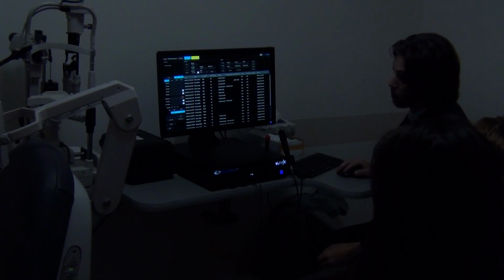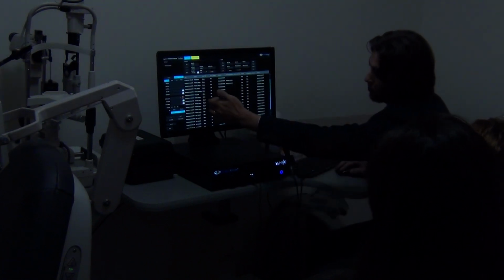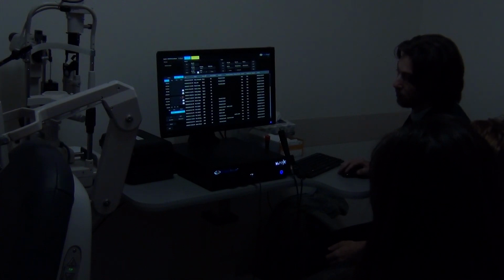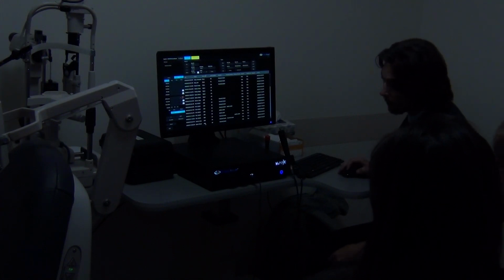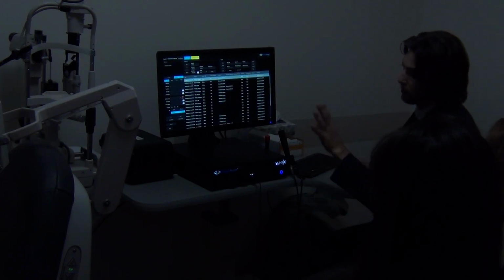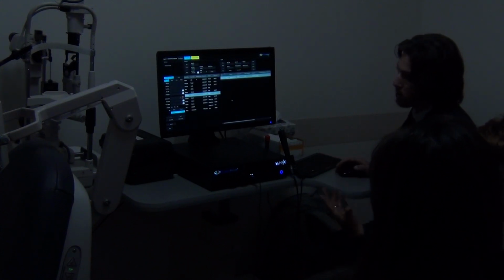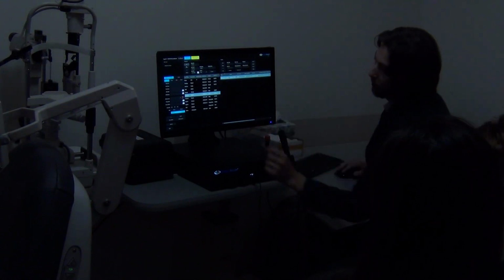So it will be either by UBMs or by B scans. And with the scroll down, you see all the B scans, then all the UBMs. So easy search, and then you can go and click on any test you'd like to. Right? So that's just a quick overview of what you can do. To start a new patient, you click the New Patient button right here.